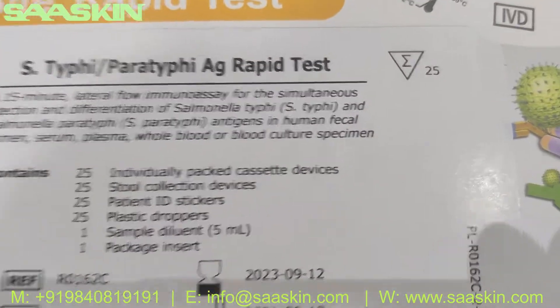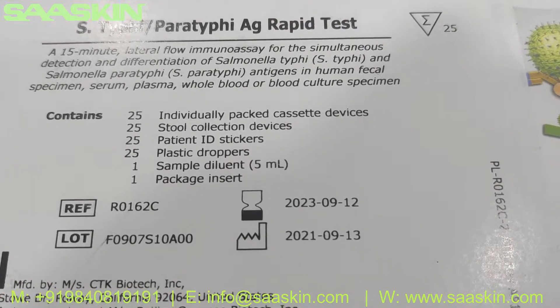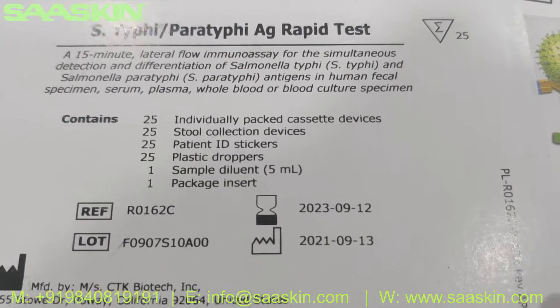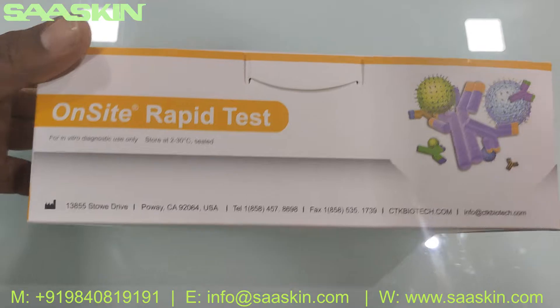So inside the box — this is a 25-test kit box. Inside the box you get 25 individually packed devices, and 25 stool collection devices, 25 patient ID stickers, 25 plastic droppers, one sample diluent buffer, and one package insert. Let me go around and show what the box looks like.